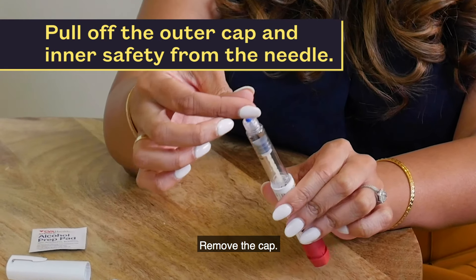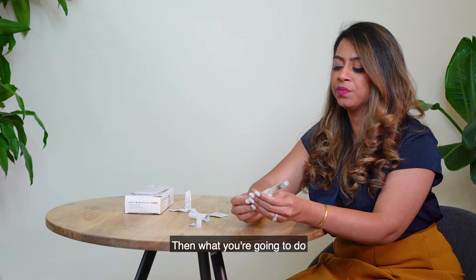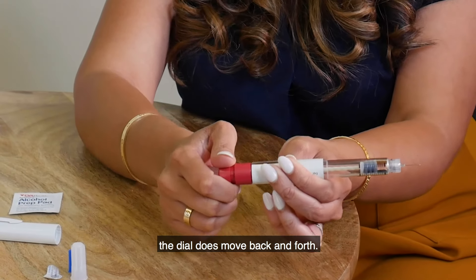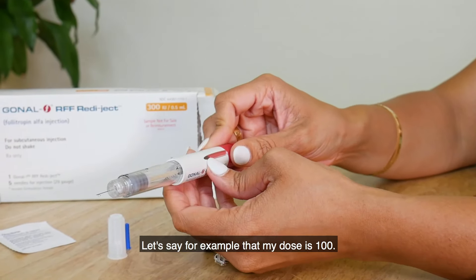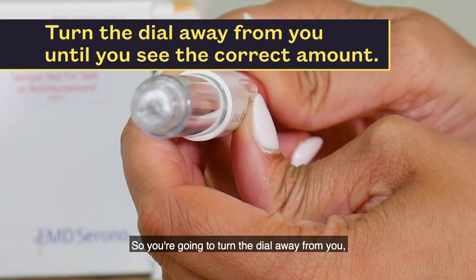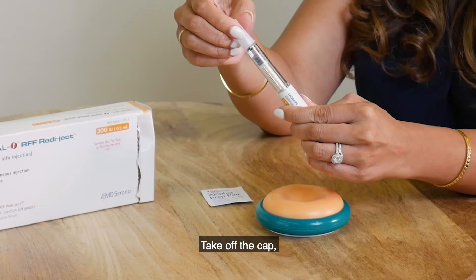Remove the outer cap, then remove the safety cap on the inside like this. Then take your dial — the dial does move back and forth. You're going to dial to the dose given to you by your patient navigator. For example, if your dose is 100, turn the dial away from you until you get the dose in the window and you'll see that it says 100. Take off the cap.